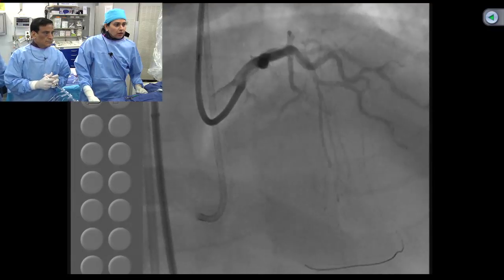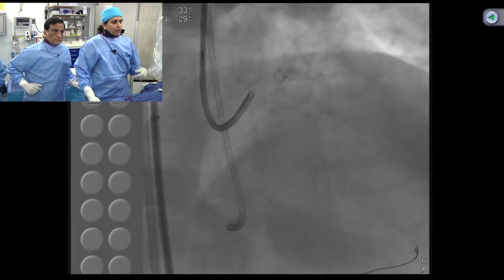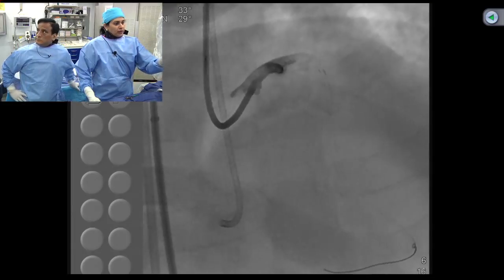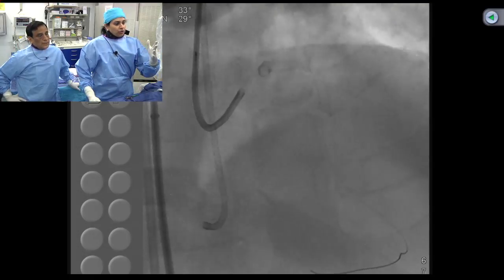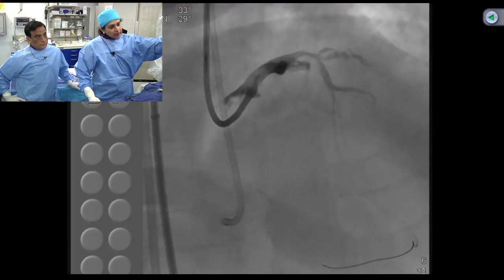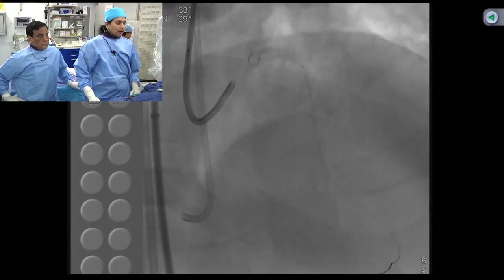Normally what has been shown and taught is that you find the septal in the angiogram, then get your Corsair all the way to the septal, take out your wire, take a picture, and decide which septal connection is a straight connection to the retrograde vessel.